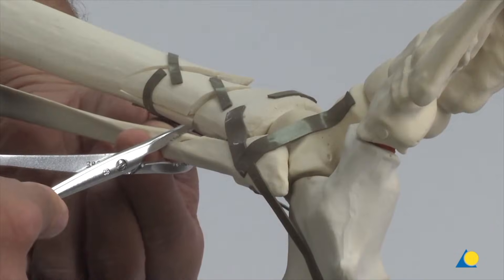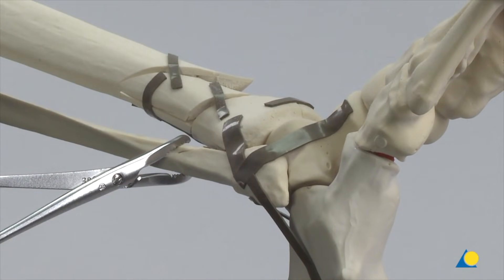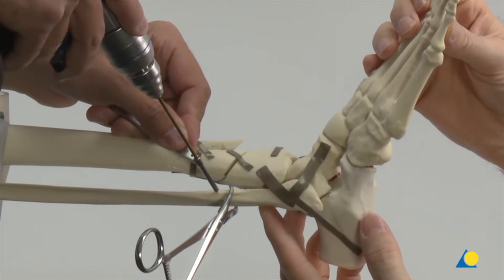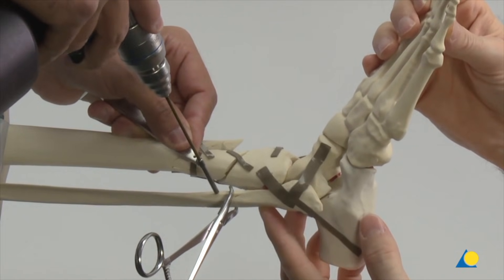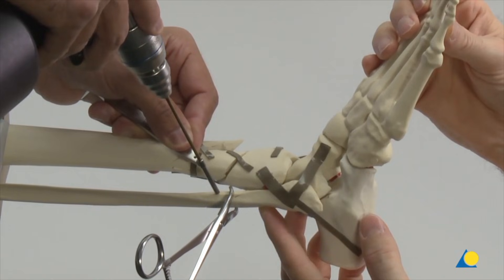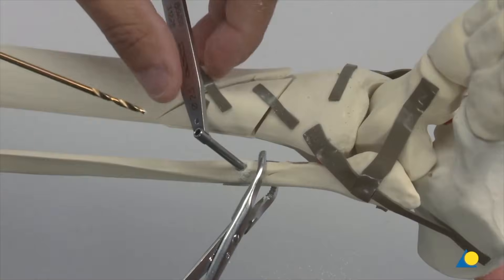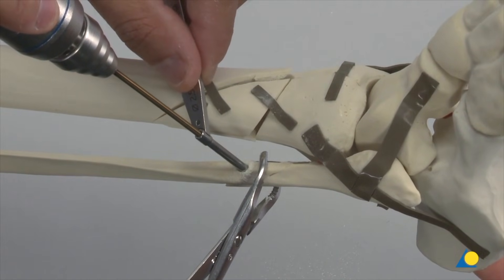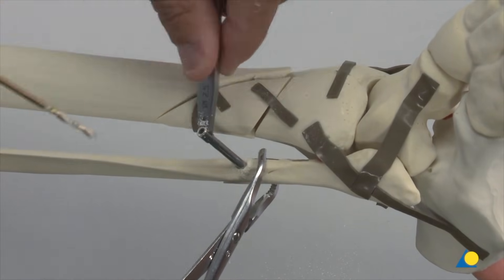The forceps is used to reduce the simple fracture of the fibula anatomically. As a first step, a lag screw will be inserted perpendicularly to the fracture surface. The 3.5 mm drill bit is inserted through the 3.5 mm end of the double drill guide and used to drill a glide hole in the near cortex. The 2.5 mm end of the double drill guide and the 2.5 mm drill bit are used to drill a hole into the far cortex.